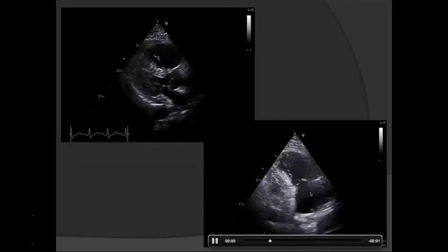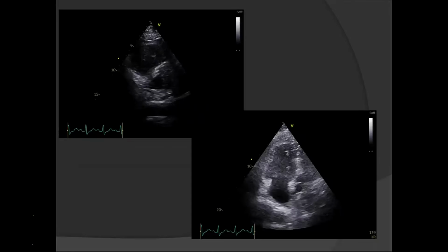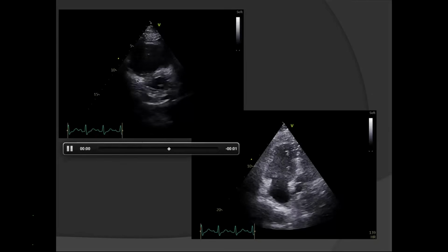So there is thrombus in transit. Pieces of thrombi can be seen clearly in RA. So a very interesting scenario where we sometimes are able to capture pulmonary embolism happening live. Short axis view again showing the septal shift pointed out by Dr. Hansa. RV is not crescent shaped. RV is much bigger in size than LV. Septum is being shifted towards this side.